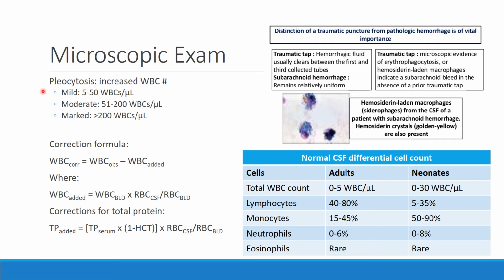Okay, so when you're talking about the patient, we saw 10 cells. Oh, that's a little bit high, right? But now your sampling error comes into play. Try and do a diff off of 10 cells. That's hard to do. So having that hemocytometer and being able to get the full count is important.